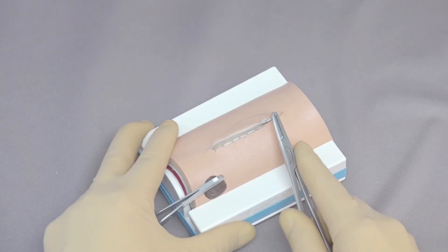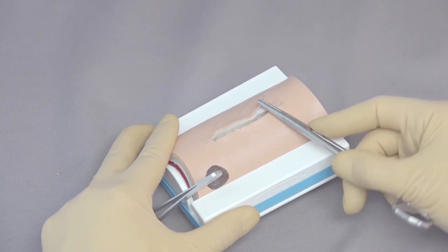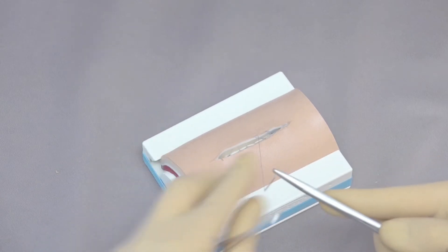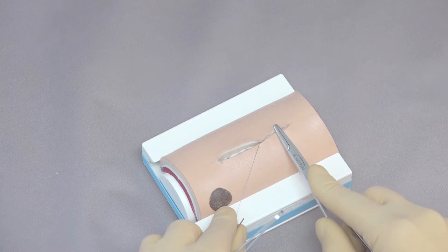So in this case, I've got a little shorter bite. And I think that's going to help me to do a better job opposing the skin in this case. So here we go. Take a shorter bite there and look at how much better that apposition is compared to that one.